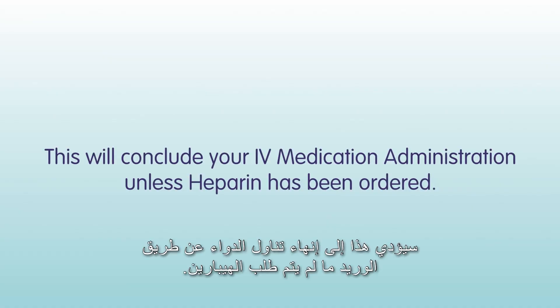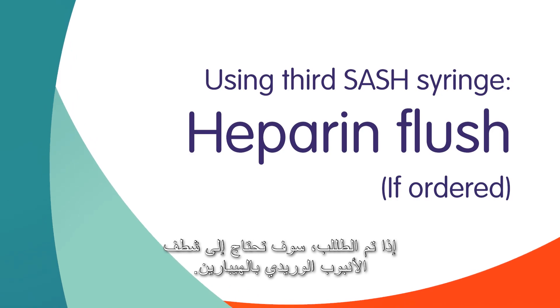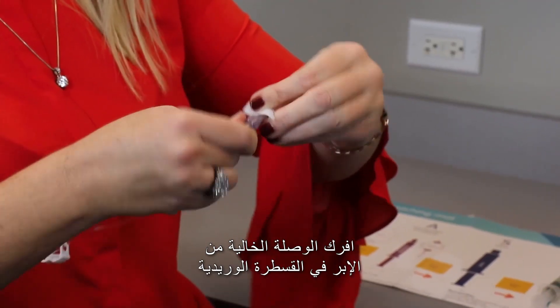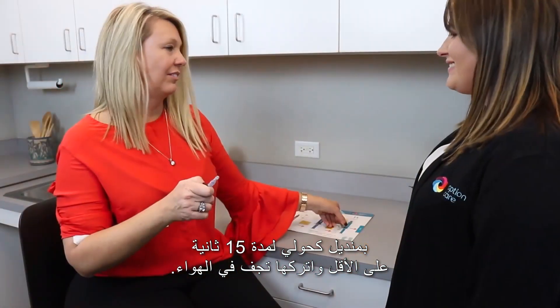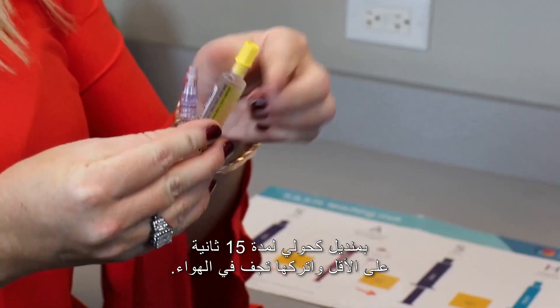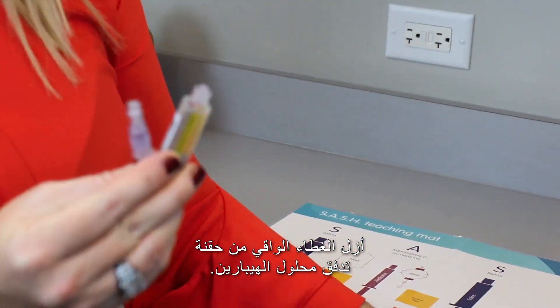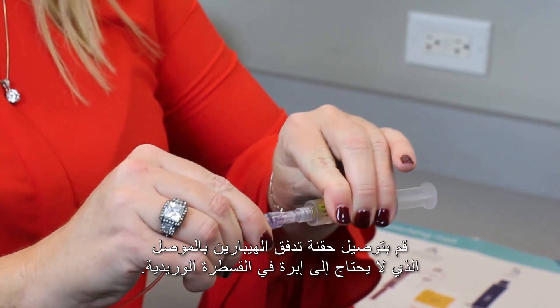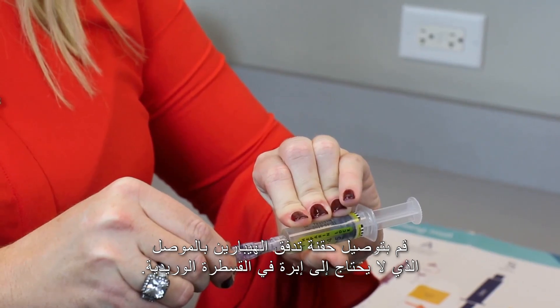This will conclude your IV medication administration unless heparin has been ordered. If ordered, you will need to flush your IV line with heparin. Scrub the needleless connector on your IV catheter with an alcohol wipe for at least 15 seconds and allow to air dry. Remove the protective cap from the heparin flush syringe and attach it to the needleless connector on your IV catheter.